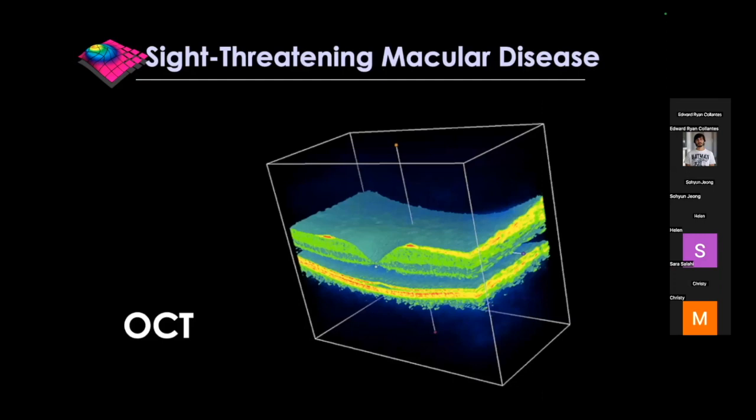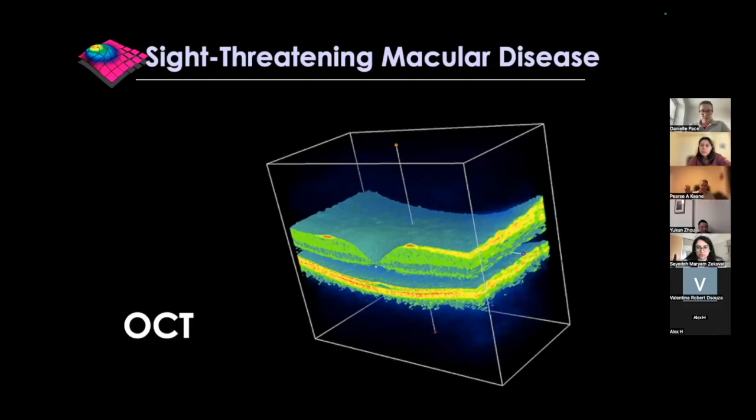model that could look at these optical coherence tomography scans of the retina. OCT is a little bit like an ultrasound, but it measures the reflection of light waves rather than the echo of sound waves. And in doing so, it gives very, very high resolution three-dimensional images, much higher resolution than an MRI scanner or a CT scanner, for example. And so could we work together to develop a deep learning system to identify people with sight-threatening macular disease and prioritize them to be seen and treated?